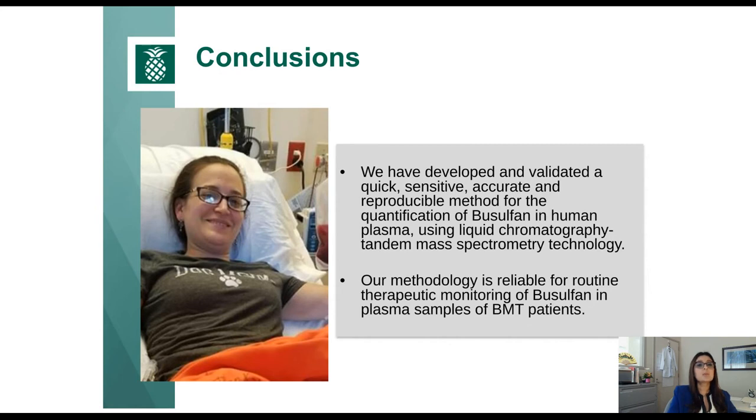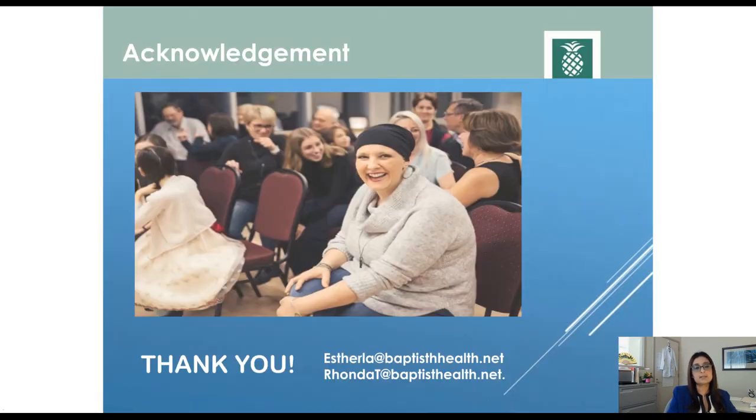The results we have presented to you today led us to conclude that we have developed and validated a quick, sensitive, accurate, and reproducible method for the quantification of busulfan in human plasma using liquid chromatography-tandem mass spec technology. Our methodology is reliable for routine therapeutic monitoring of busulfan in plasma samples of BMT patients.